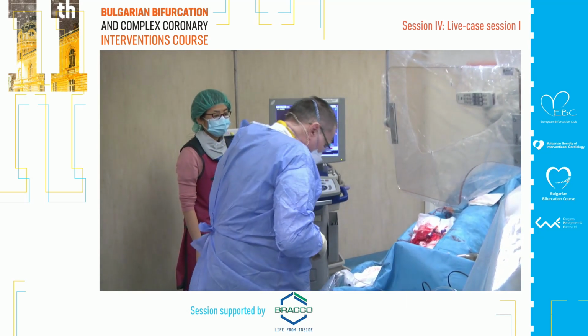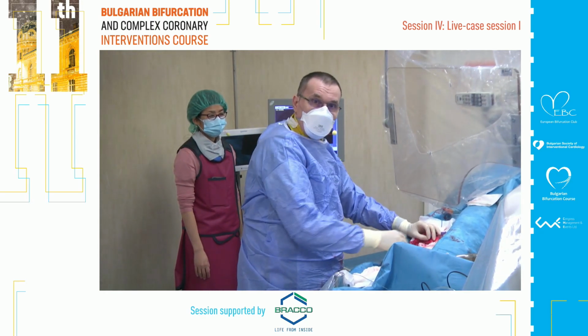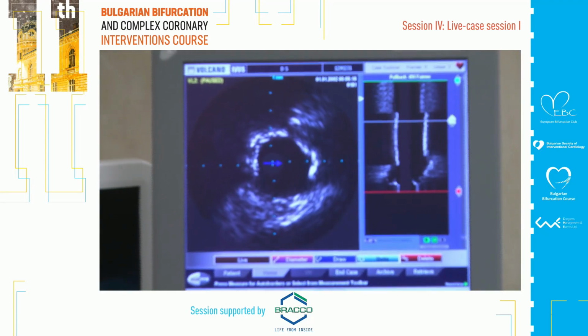Can we see the IVUS again? We have not seen it. Can we see, Dobrin? Okay, we see your head. Show us. We see your head, Dobrin. Yes, okay, now we see the image. Yeah, okay, thank you.